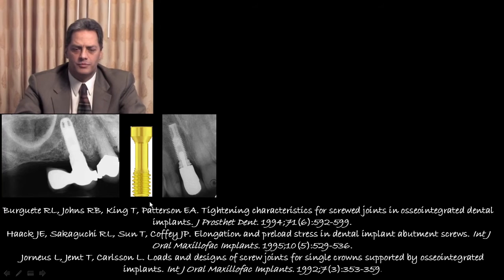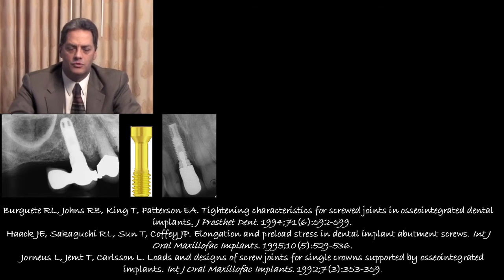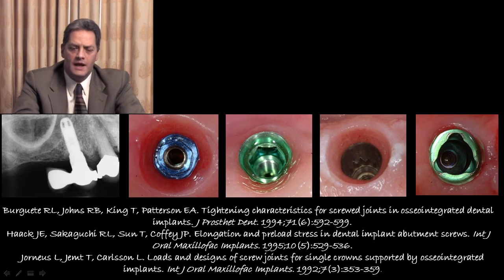But screws have been improved over the last decade, and they have a tougher resistance to fracture. So this is something that we'd like to incorporate into our new restorations. And here we have a slide where we see the evolution that has taken place with different implant designs. From the external connection, we have different internal connections trying to prevent screw loosening.